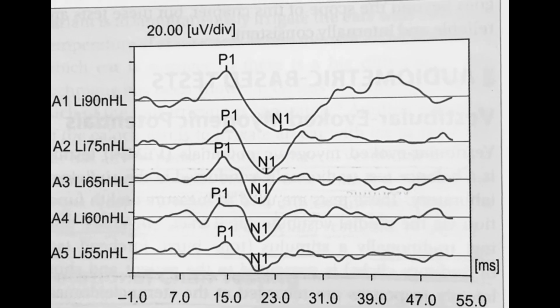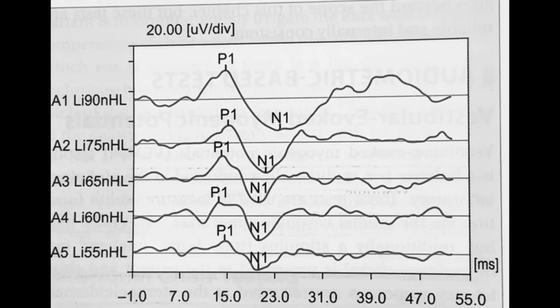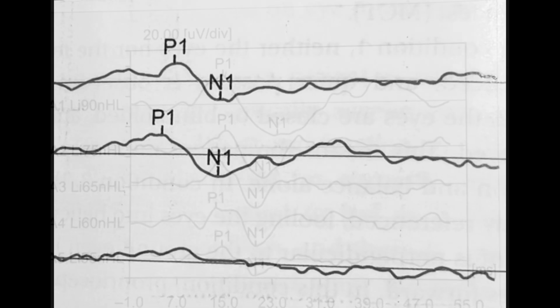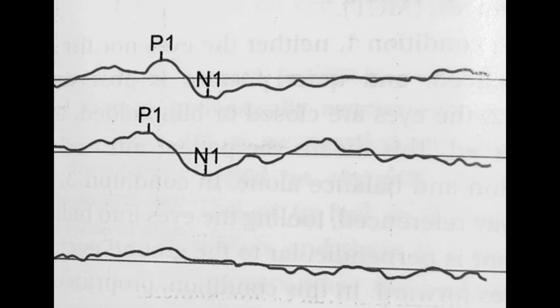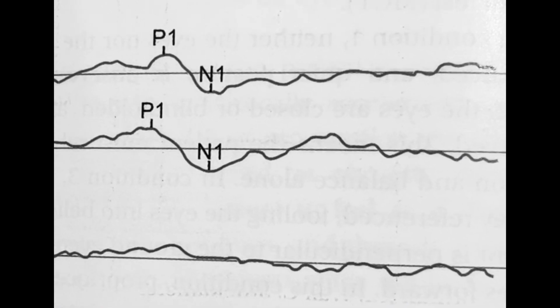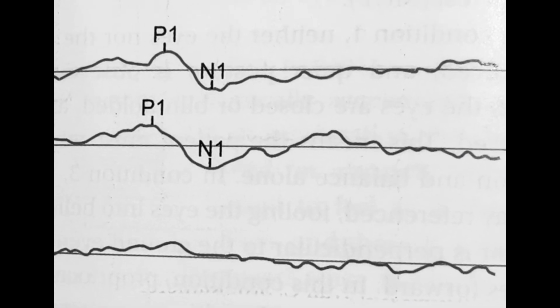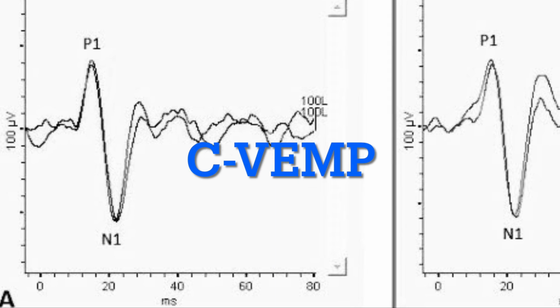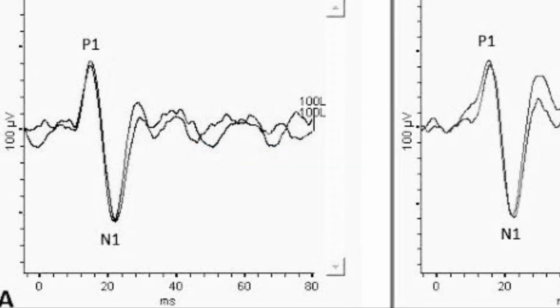Over time, the clinical applications of VEMPs have expanded. While initially used for diagnosing superior canal dehiscence, VEMPs are now being explored in evaluating other vestibular pathologies, including Meniere's disease. These tests provide a valuable window into otolith function and contribute to a more comprehensive understanding of vestibular disorders.